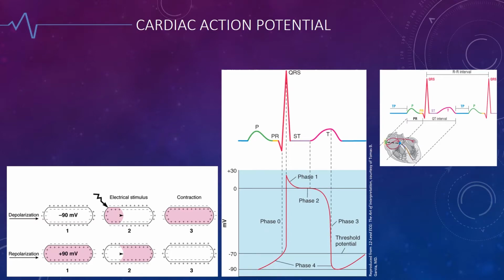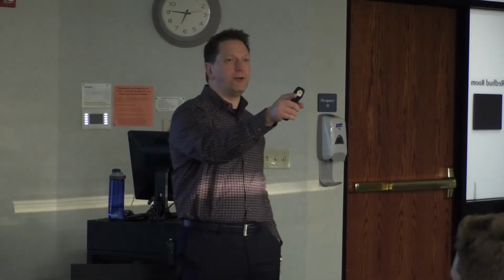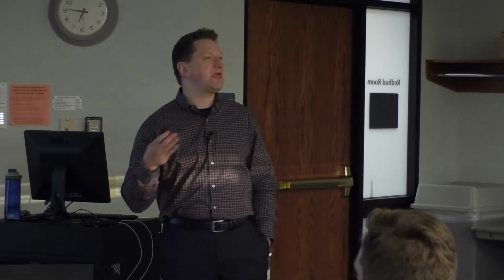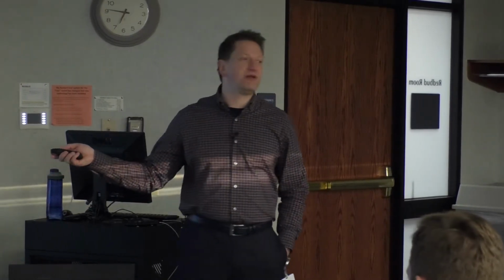Fortunately for us, the heart operates in an orderly sequence, which by its very definition separates a lot of these signals for us, okay? So we have the P wave, which represents what? The P wave is the atrial depolarization. The QRS represents the ventricular depolarization. And within the QRS, what silently happens? Atrial repolarization, which is such a weak and pathetic signal that you cannot see it at all. And then there is the T wave, which is the ventricular repolarization.